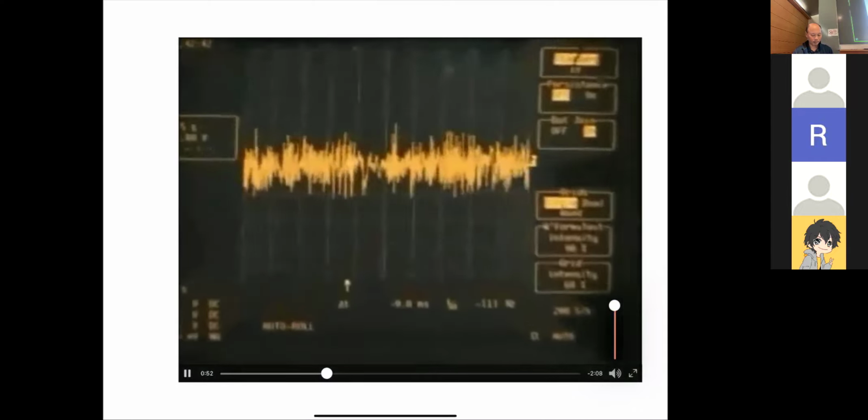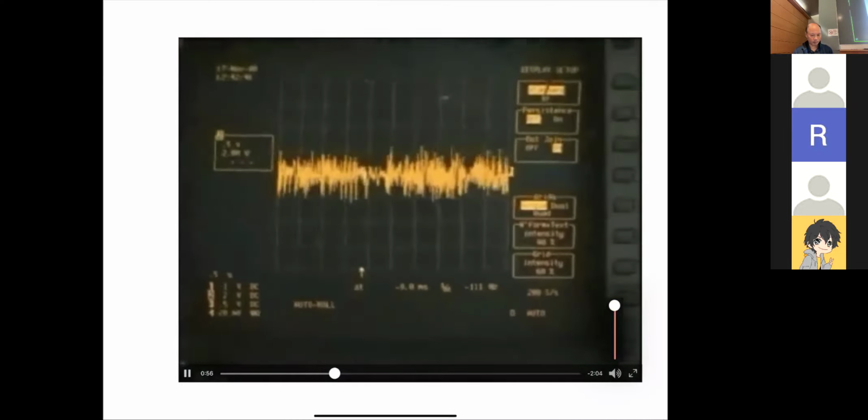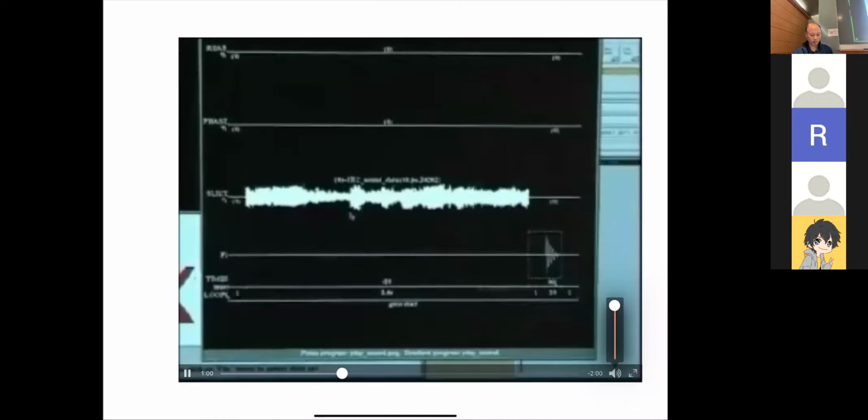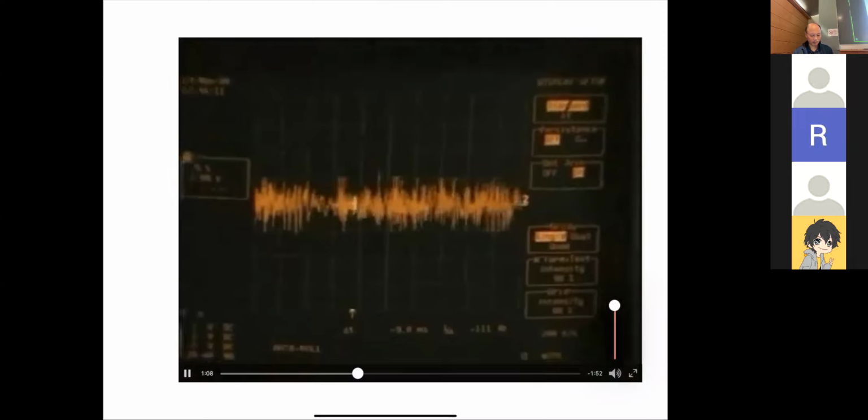Only a few lines of pulse program code are necessary to output the array to the gradient waveform controller. Shown here on the oscilloscope is an example of the current output of the gradient amplifier of the digitized bagpipe sound file. Here is a view of the Bruker ParaVision pulse programming tool showing the 32 kilobyte digitized waveform of the Scottish bagpipes played out on the slice selection gradient.